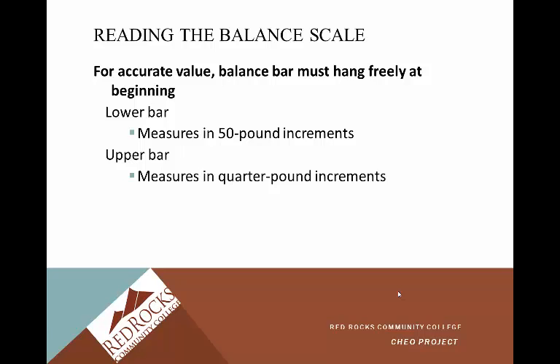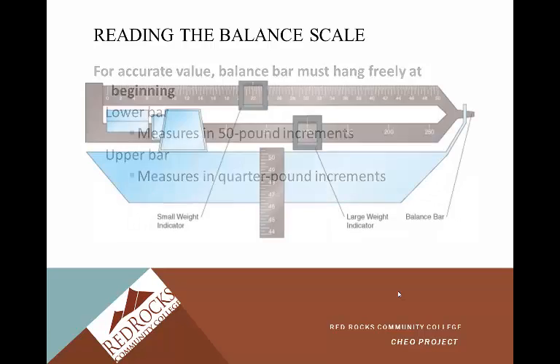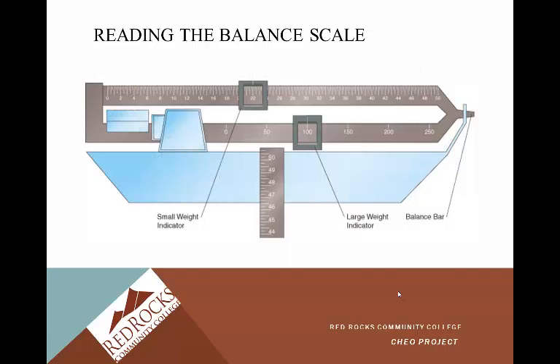The lower bar measures in 50-pound increments — starting at 50, then 100, 150, 200, and so on. The upper bar measures in quarter-pound increments. You have a small weight indicator at the top for more precise readings, and a large weight indicator at the bottom that gets you to the nearest 50-pound increment. When weighing somebody, you move the large weight indicator first.